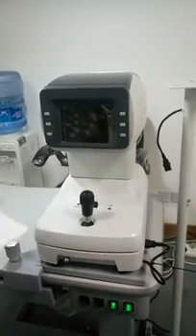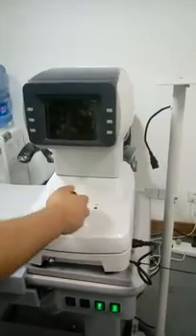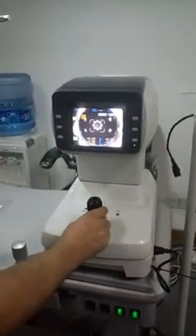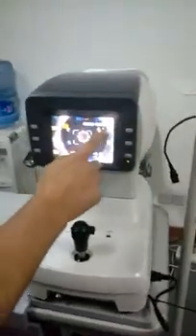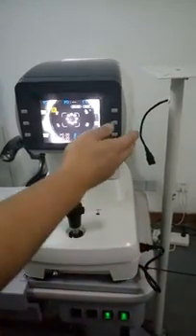Let me introduce one of our most popular auto-refractor keratometers, the KR-1000. As you can see, it features a refractometer with keratometer functionality and the traditional six buttons on the front panel.